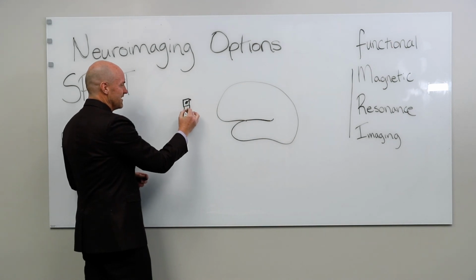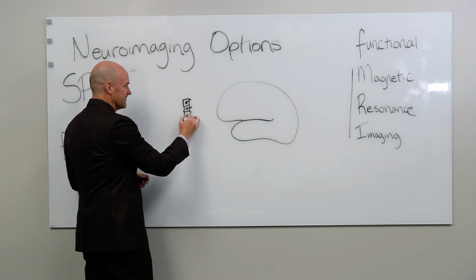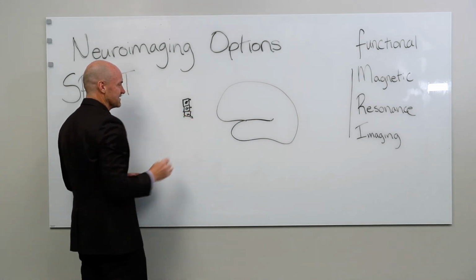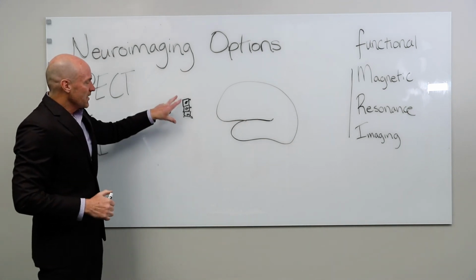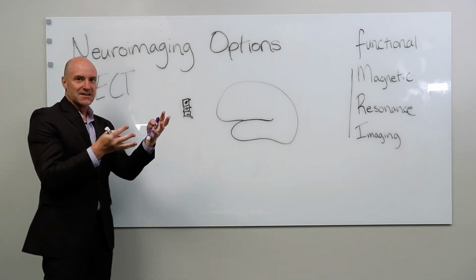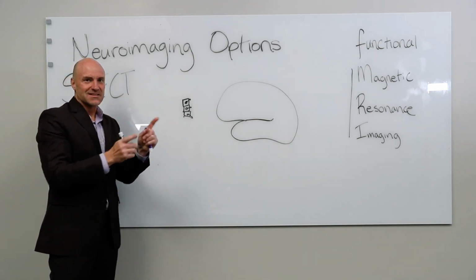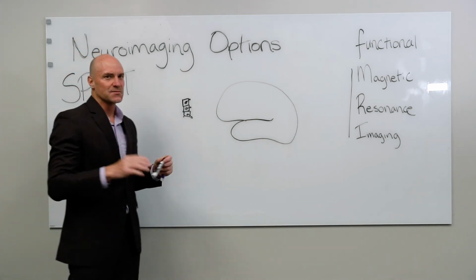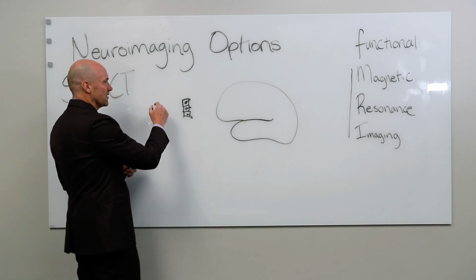Then you have another area that's magnetized some other way, and another area that's next to it that's magnetized in some other way. And so you apply magnetic fields, and you manipulate those magnetic fields so that different tissues are magnetized at different levels in different directions and so on. And that's a really simplified version. The other component to it is a radio wave.